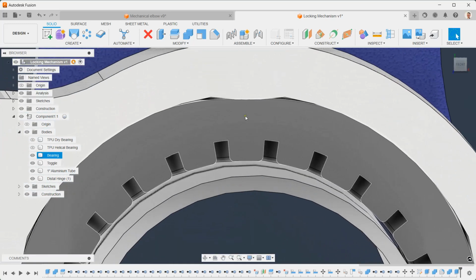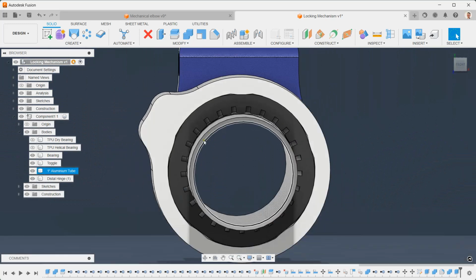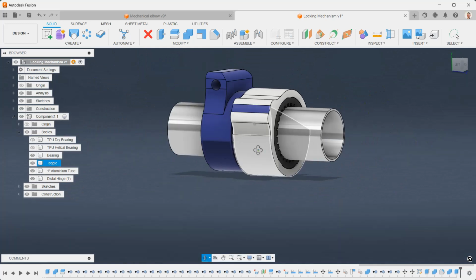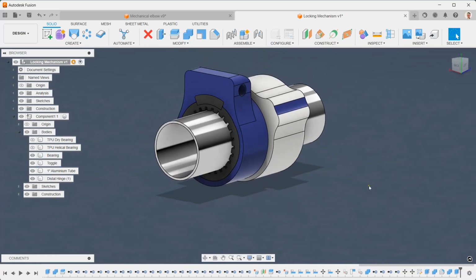So if you look there, the tolerances are a lot tighter, so it's going to be fiddly dialing it in. But thankfully, I have some TPU now printing just a small ring to see if it'll fit around the 25mm pipe. In terms of how that changes the design at the back, previously the irregular shape was being relied on exclusively to seat into this sliding hinge.